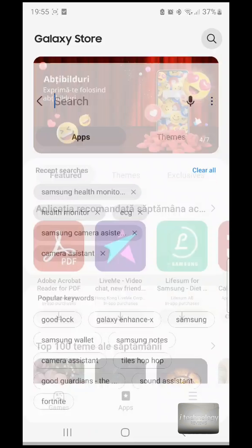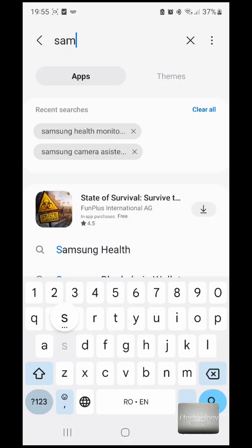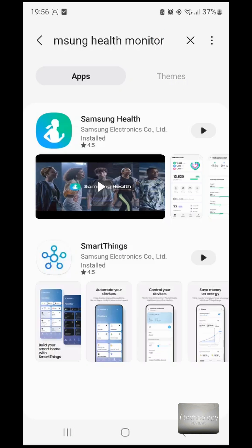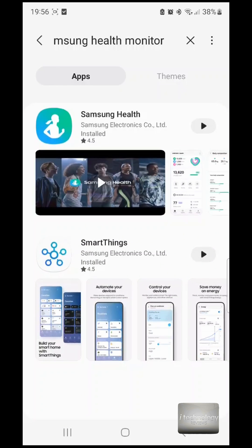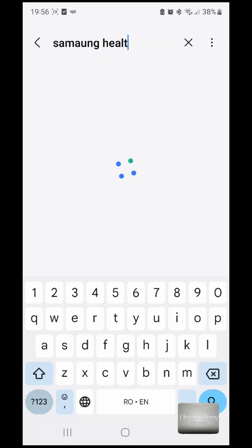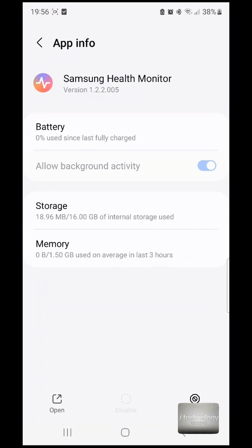You can search in two ways: for the smartwatch or for your phone. If you put Health Monitor, you will find nothing — Samsung Health comes up, but that's not the application we need. Another way is to search directly from your smartwatch. Let's search Samsung Health Monitor — and it's like this. This is the application, but it will open on your watch.